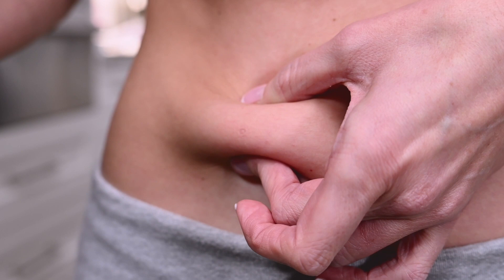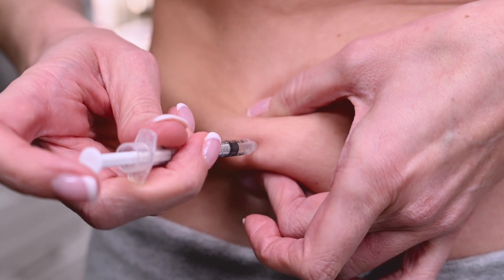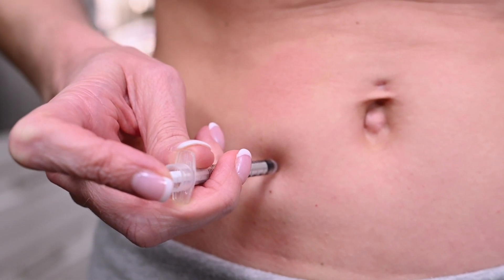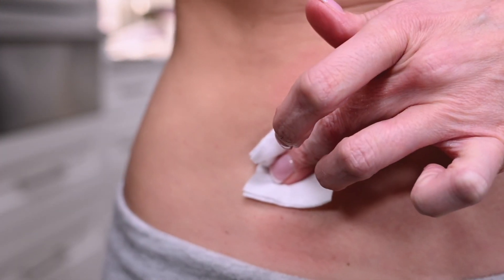Hold the syringe in your preferred hand. Pinch a fold of skin between your fingers and insert the needle at a slight angle. Release the skin after the full length of the needle is inserted. Push the plunger until all the medication is administered into the injection site. Gently remove the syringe and apply pressure with gauze.